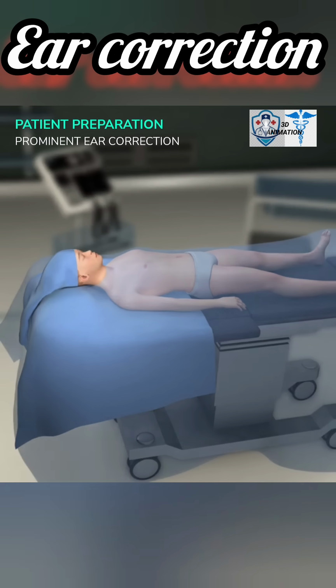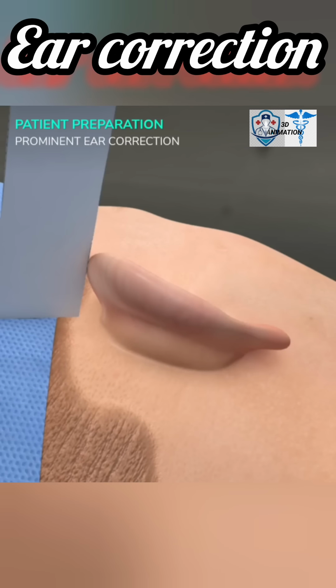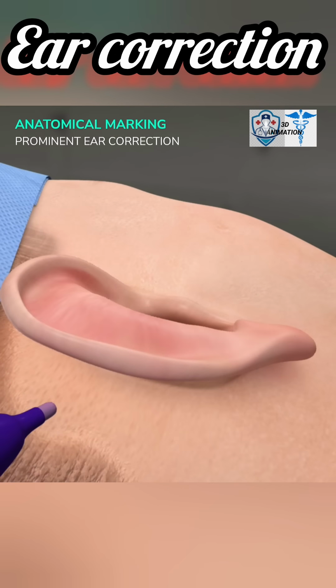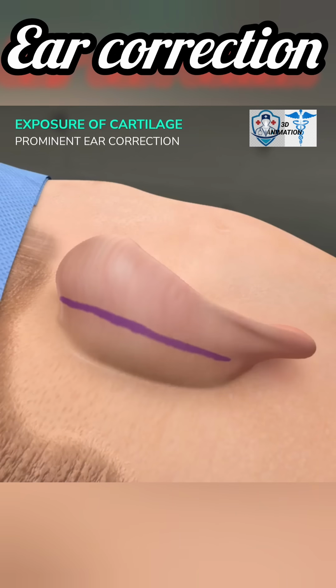Drape the patients. And use the ruler to measure the distance from the mastoid to the outer edge of the helical rim at the upper, mid, and lower point of the ear. Fold the ear back and identify the position of the anti-helical fold. Use the marker pen to draw a line on the back of the ear in line with the anti-helical fold.